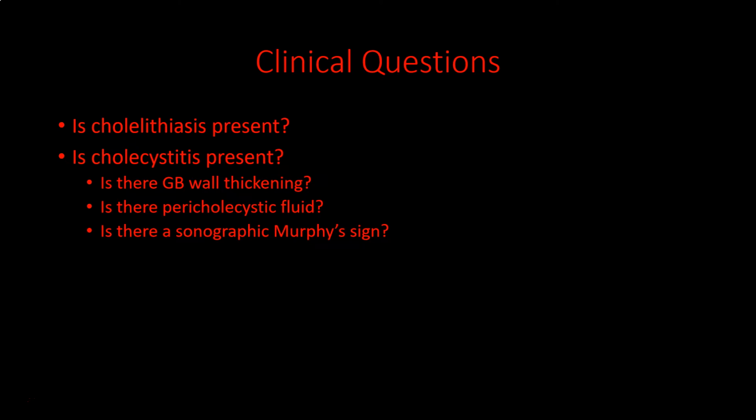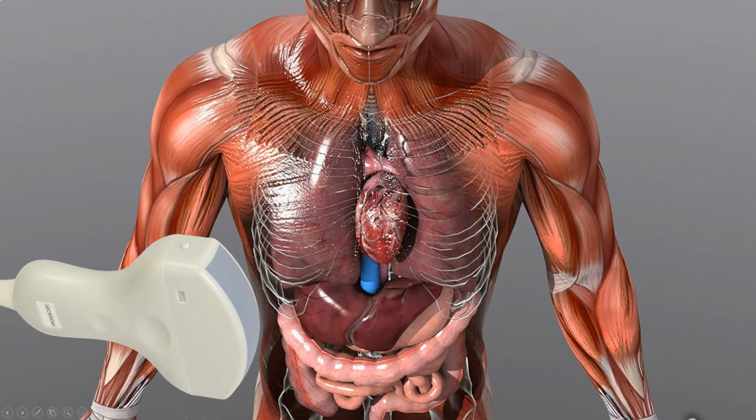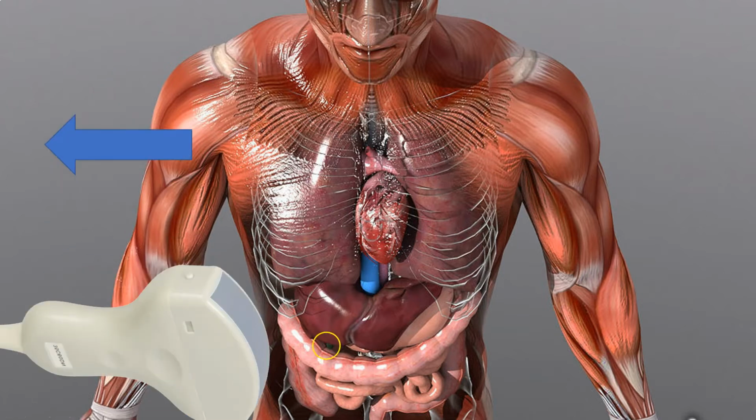So let's talk about how you're going to have the probe placed. If you're looking out lateral, the probe is going to be out here on the right-hand side, with the probe marker pointed towards the patient's head. And this is the first view you're going to take, and you're going to sweep through. As a reminder, probe marker always goes up to the head or patient right, except in cardiac, as you've already seen. If you are ever confused about where that probe goes, just think through those two basic rules and you'll be fine.